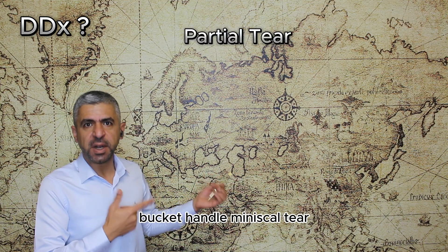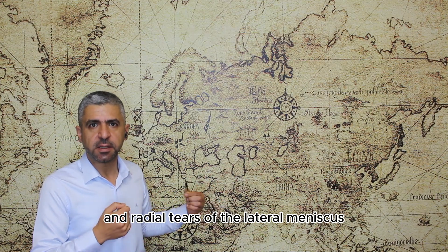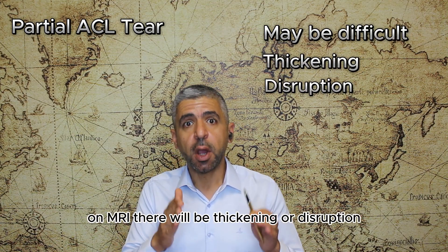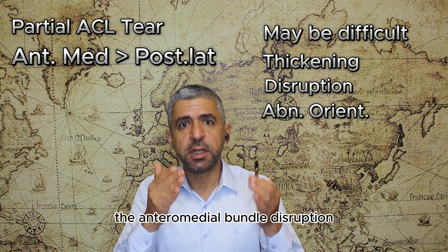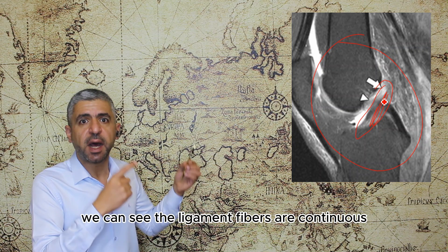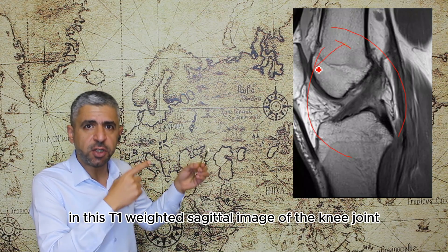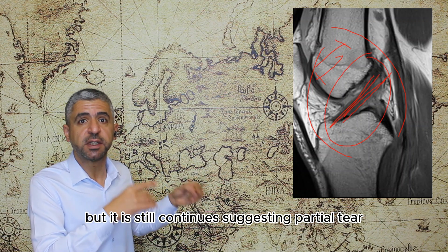The differential diagnosis of ACL injury includes partial tear, bucket handle meniscal tear, mucoid degeneration of the ACL, and radial tears of the lateral meniscus. Partial ACL tear may be difficult to diagnose on MRI — there will be thickening, disruption, or abnormal orientation of some ACL fibers, with anterior medial bundle disruption more common than posterolateral bundle disruption. On this T2 fat saturated sagittal image, ligament fibers are continuous but edematous suggesting partial tear. On T1 weighted sagittal imaging, disruption of some ACL fibers with maintained continuity also suggests partial tear.